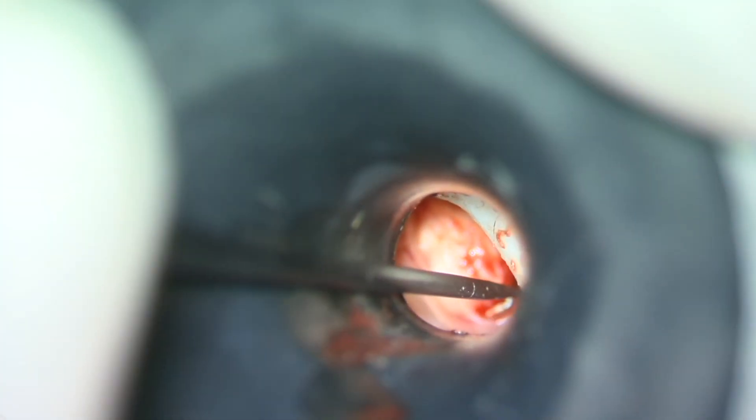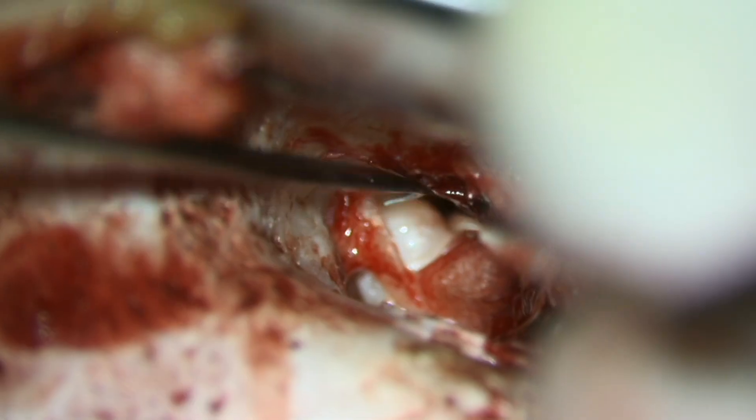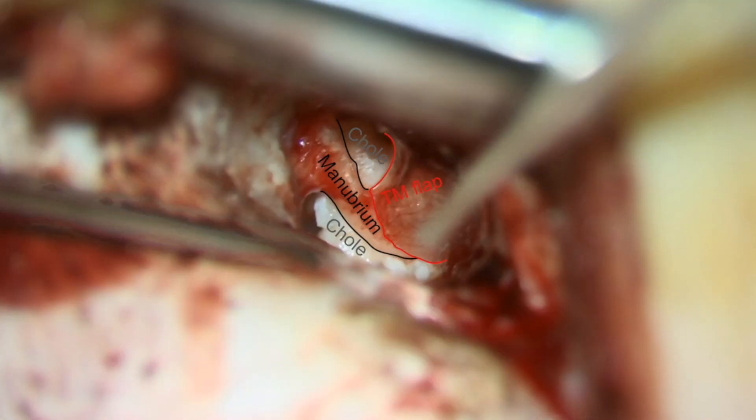We then repeat the same procedure of incising the tympanic membrane and bluntly dissecting the cyst wall along the posterior margin of the cholesteatoma. At this point we've done pretty much all we can through the ear canal, so we flip the ear forward, make a posterior incision, and raise a tympanomeatal flap.